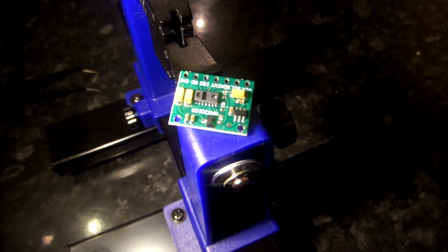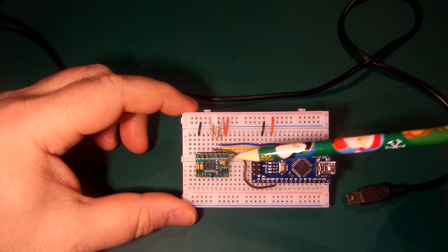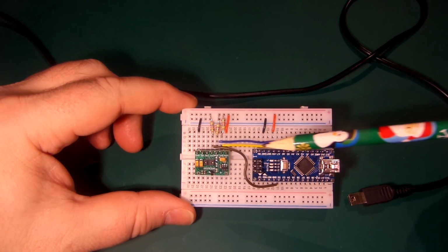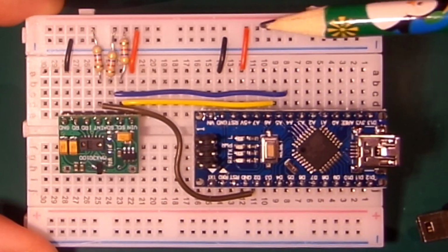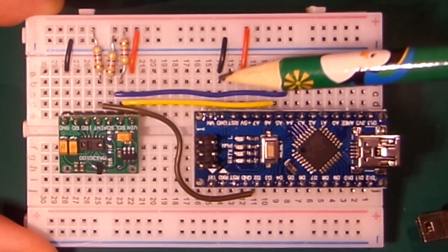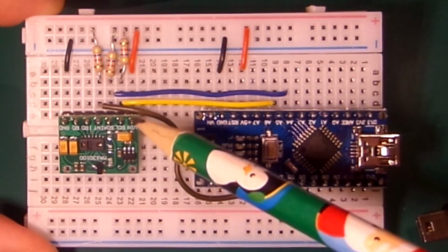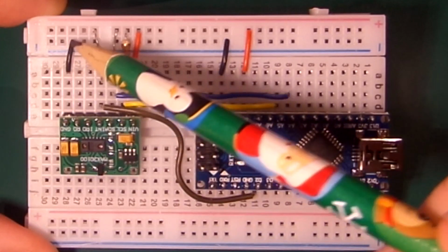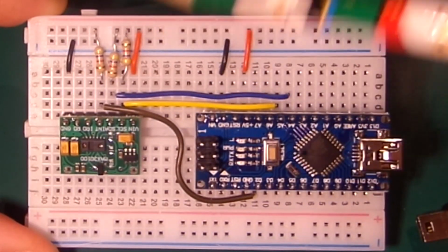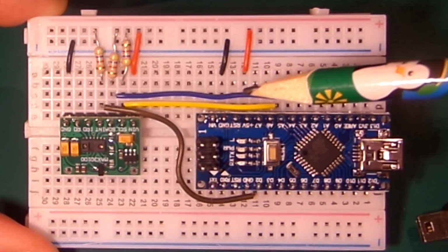Let's move on to actually building onto the circuit board. So here we are, all mounted up on the board. It's an I2C device, as I've mentioned before, but you can see that I've connected the 5 volts of the Arduino to the 5 volt rail here, and the ground to the ground rail. And on this device, we've got the VIN, so that's gone straight to the positive rail, and the ground straight to the ground rail. No real surprises there.